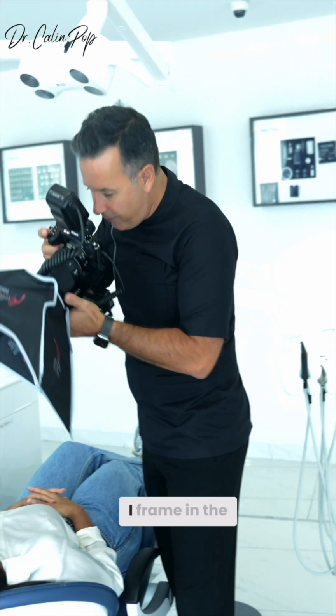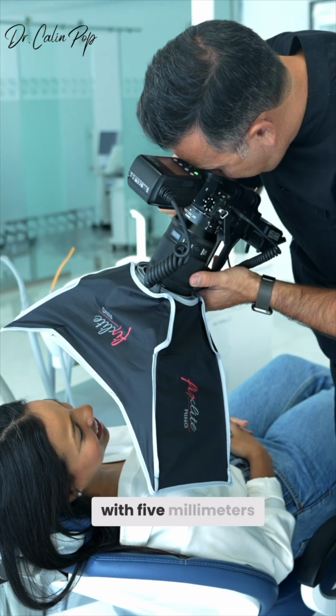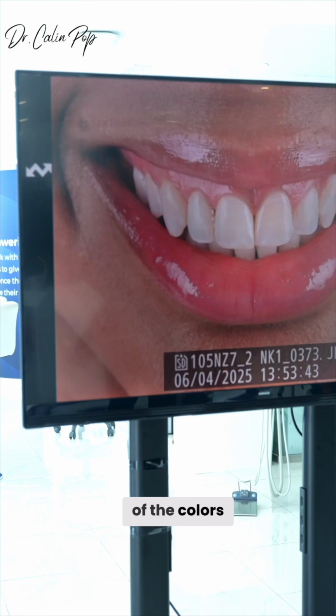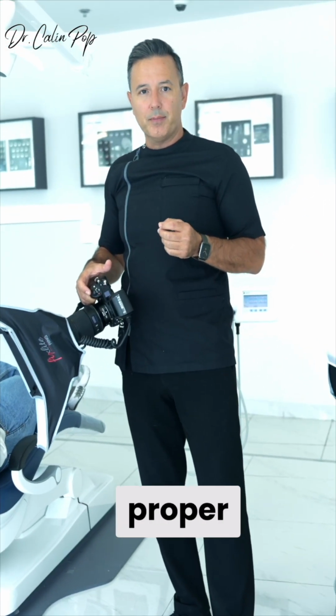Okay, let's shoot. I frame in the same way. What I see in the viewfinder is buccal commissure to buccal commissure as a reference with 5 mm left and right. And I have the same representation of the colors as it was with the Fixlite twin. So as a conclusion, get your colors right by managing the white balance, the color temperature, and also choosing the proper picture profile.